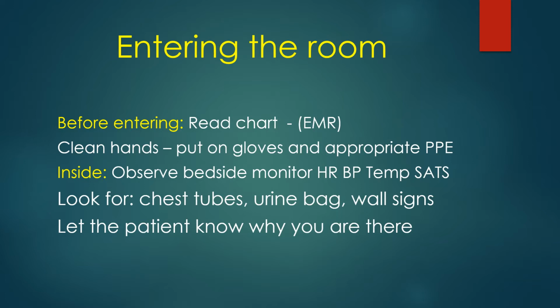Also, you may want to ask the patient, how's your breathing? We're checking the ventilator, make sure everything is set right for the patient, but the ventilator doesn't tell us all there is to know. We can ask the patient, how is your breathing? And the patient may indicate that his breathing is good, that's okay, or that it's not good. He may indicate to you that he needs more ventilatory support. So it's very important to communicate with the patient.